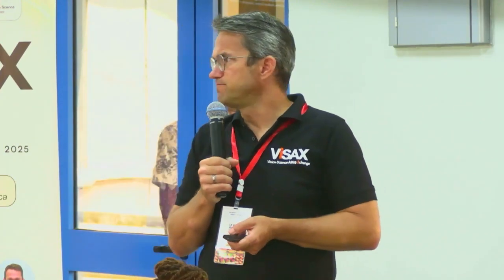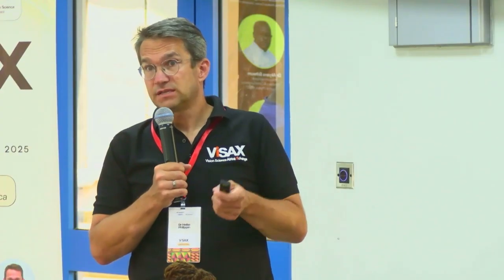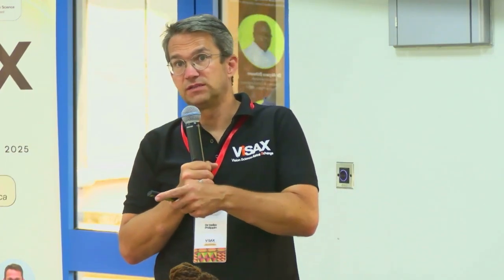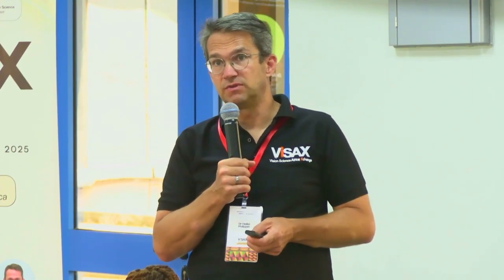You do an RAPD, but sometimes in more subtle variants, and also to follow up the patient, it might be helpful then to do a pattern ERG or a VEP or pattern VEP. That's actually another reason, which was already mentioned in the other lecture this morning, to follow up patients, also to see if they are progressing or not. It might be another reason why electrophysiology can be helpful.